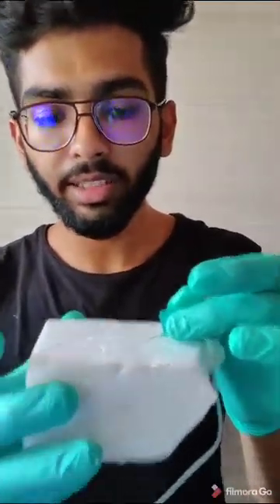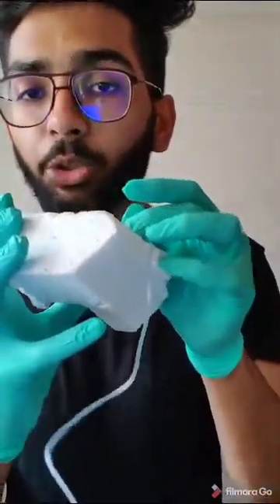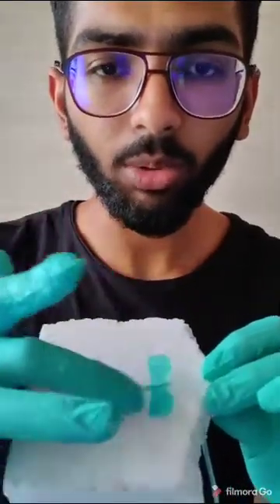So for stopping that, you make sure that this here should stay closed. The other side of the scalp vein set should be closed. As I punctured here, as you can see, intravenously, we will be able to recognize it by the blood in the tube here. We will make sure with the help of surgical tapes that it stays stable. I'm sorry, I do not have that available with me, but we need to make the tape one over here, one over here, one over here, and one underneath the set for making the scalp vein set stable.